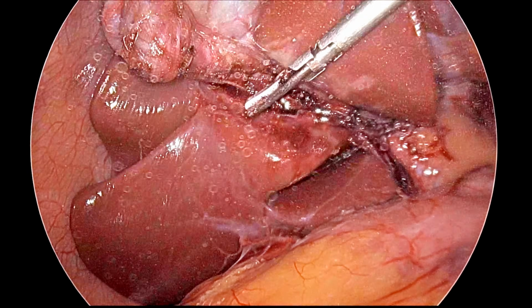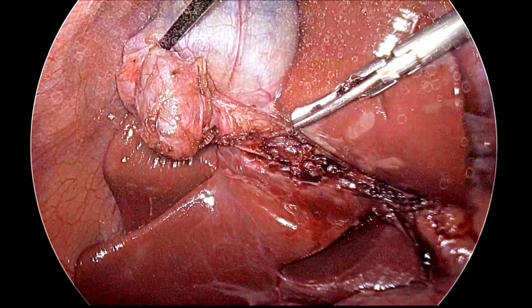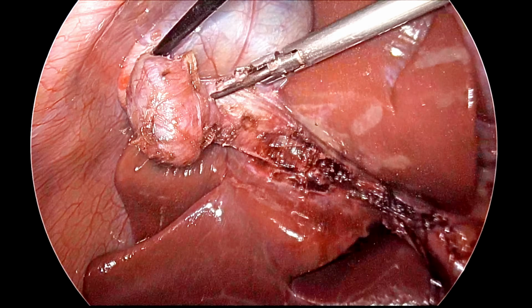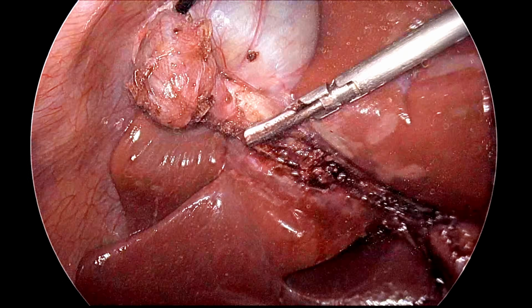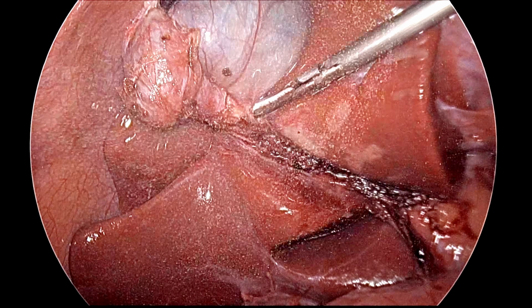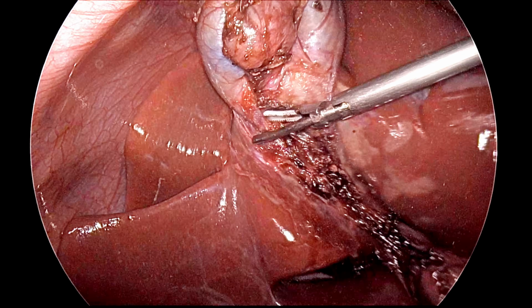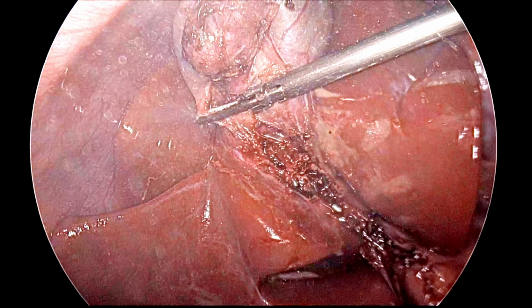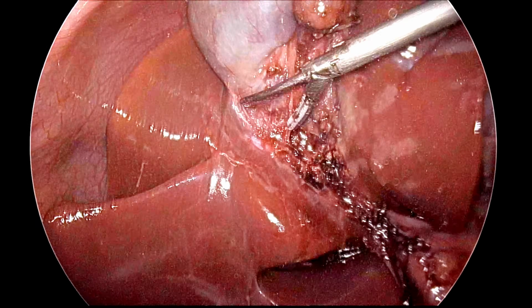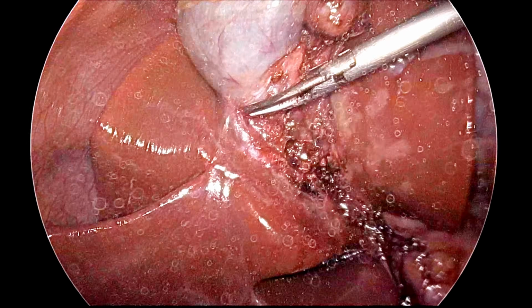So this is a clipless cholecystectomy, and we can see the sealing of the gallbladder, which is not leaking, that means it is fully sealed, and a good areolar plane should be maintained, and the remaining gallbladder will be separated from the liver. Anterolateral, anteromedial traction should be given. The Teflon jaw again we should keep towards the gallbladder, so there should not be any puncture.